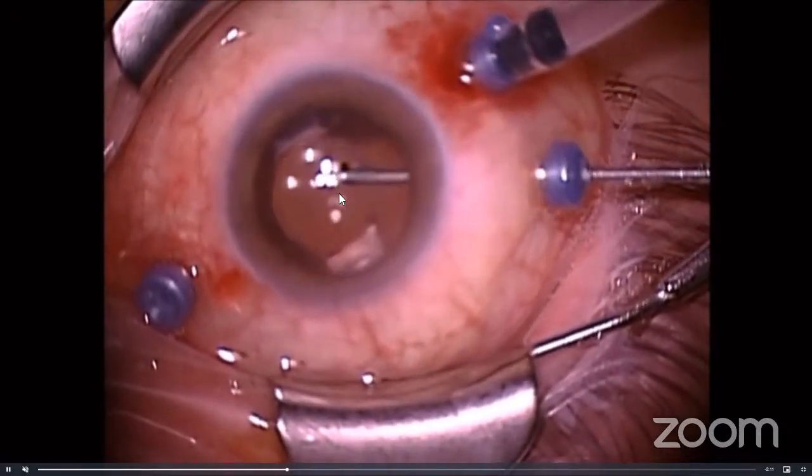Okay, he moved on to clear anteriorly. In this case, we can see that it's a pseudophakic eye, so that's why you can easily clear the vitreous at the anterior part of it. So now he tried to inject the heavy liquid to stabilize the posterior pole or the macula here. Usually we inject directly on the optic disc and maintain a single bubble.